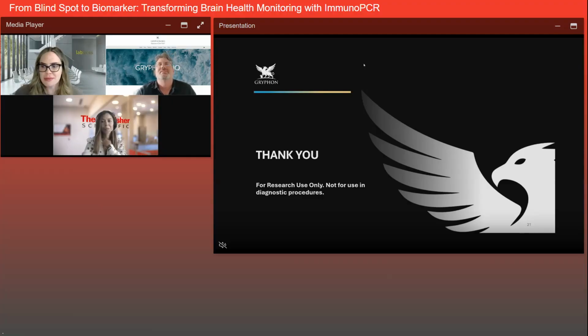Yeah, I mean, it's a good question. There's so many biomarkers that you could potentially measure and so many in the literature. Where do you start? And in particular, the question asks about what are the most reliable. So what we typically do is try to find what are the gold standard biomarkers in that indication. So neurofilament light, for example, very important across indications. So you definitely want to have some CNS specific markers like that. And then, for example, interleukin-6 is a well-known pro-inflammatory cytokine.